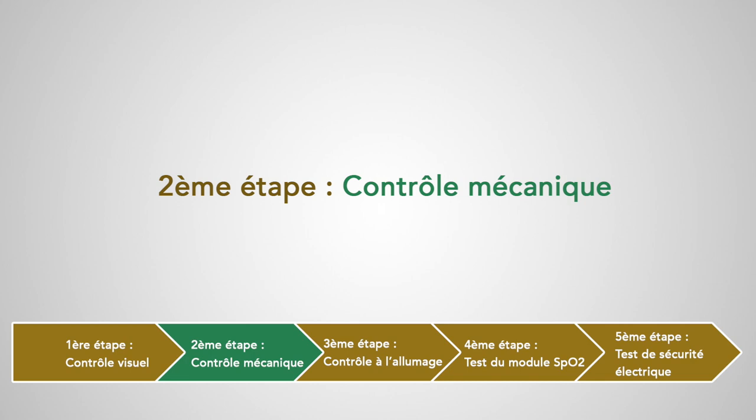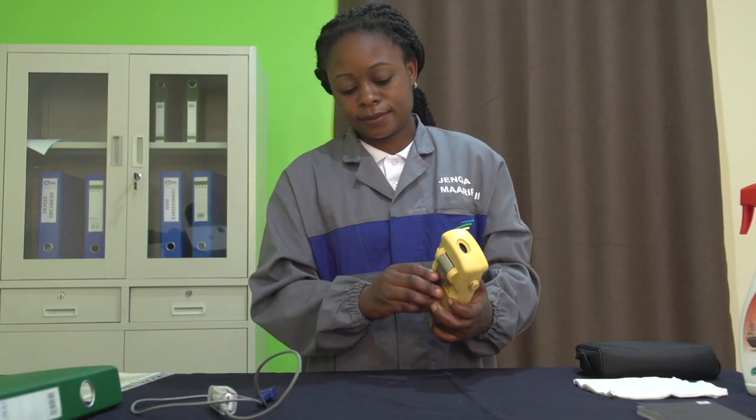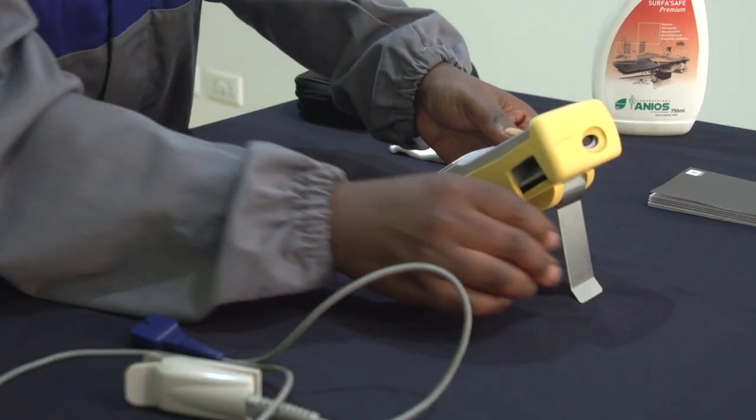Deuxième étape : contrôle mécanique. On va vérifier ici l'état du support et l'intégrité du châssis.